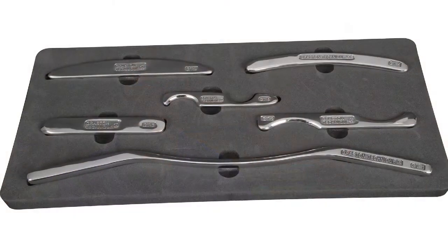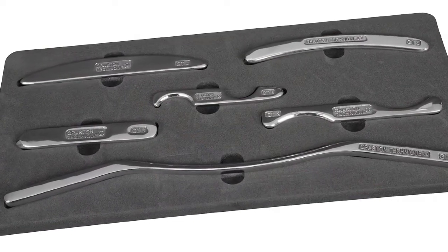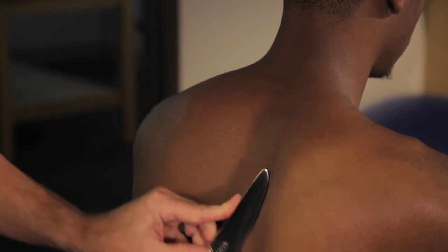Our Module 1 training is a basic training, 12 hours, during which we introduce participants to the concept of instrument-assisted soft tissue mobilization. We teach the intricacies behind our six instruments with their many treatment edges, angles, hand holes, and various applications to the different regions of the body.